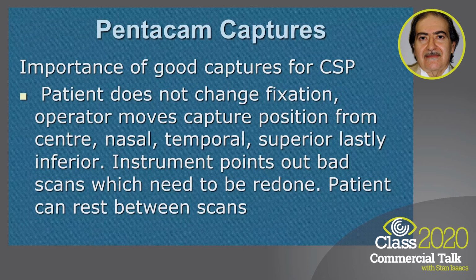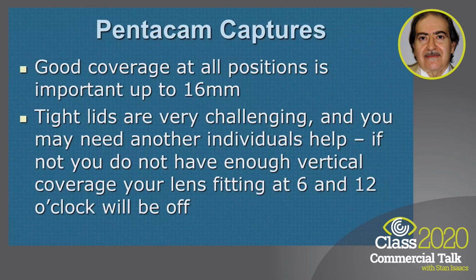The disadvantage we have in Asia, where we do all these fittings, is that Asian eyes are not exactly very, very large, and it's very hard to get full scans to cover most of the cornea and sclera, which you need for your fittings. So you need to have good coverage, and with tight lids, it's challenging. And at a conference in Tokyo, I came across a little gadget which helped us quite a bit. Let me just show this to you.